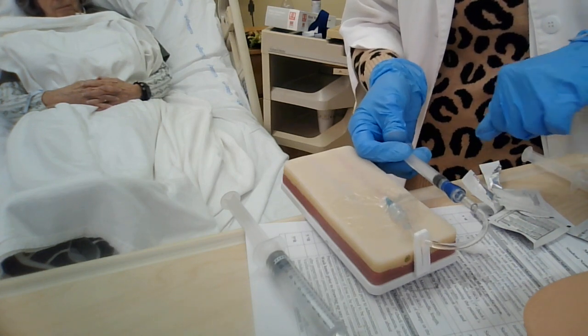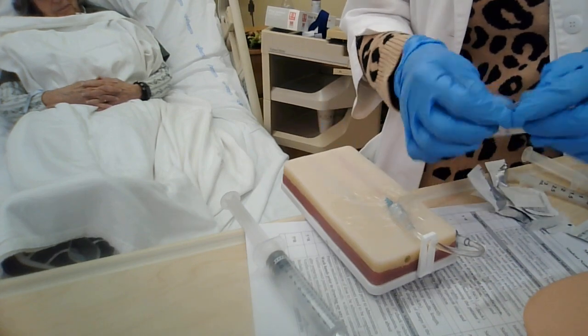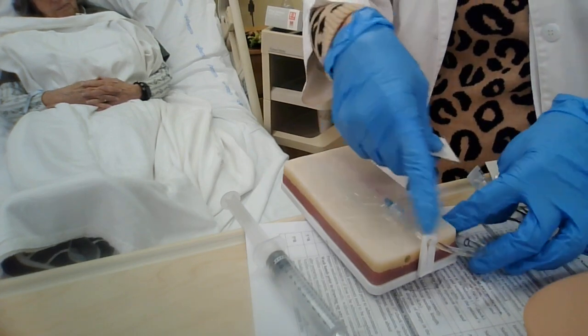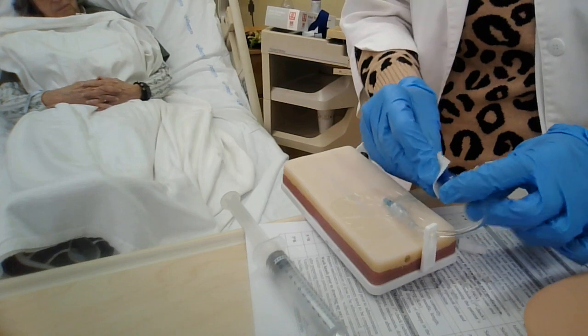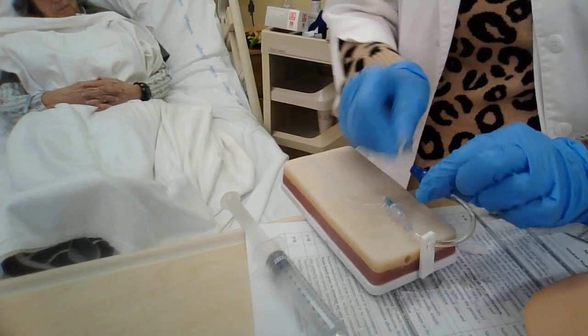Okay, so it's been a minute. I've given the 20 milligrams. Now I'm going to go ahead and take another swab. There's still medication in this line that we need to push through. So that's why we do that last one. So scrub it for a good 5 seconds.